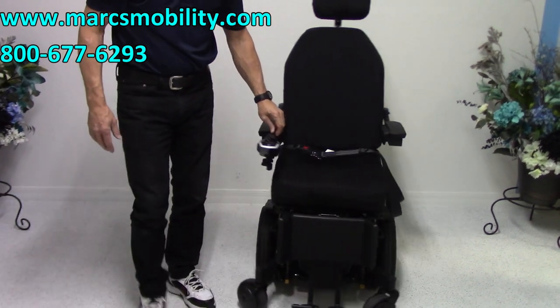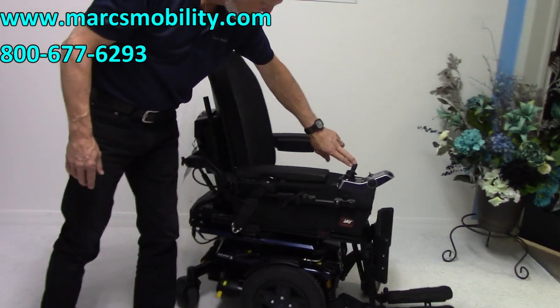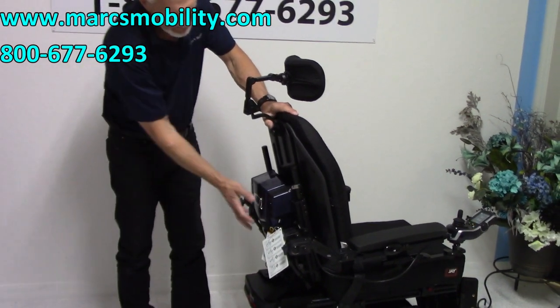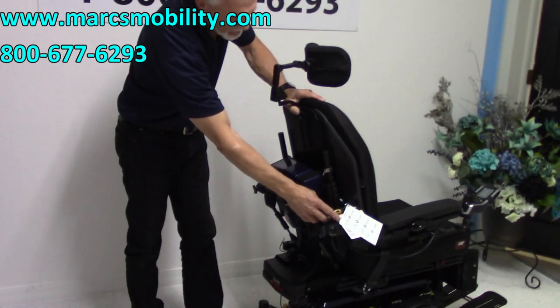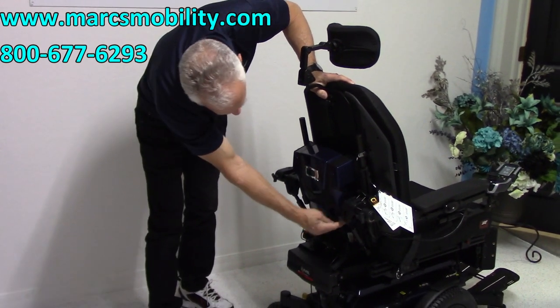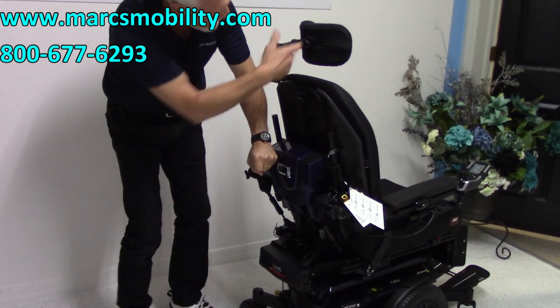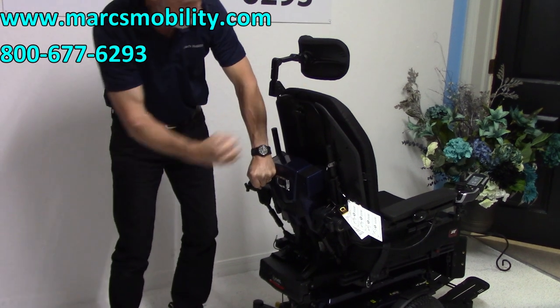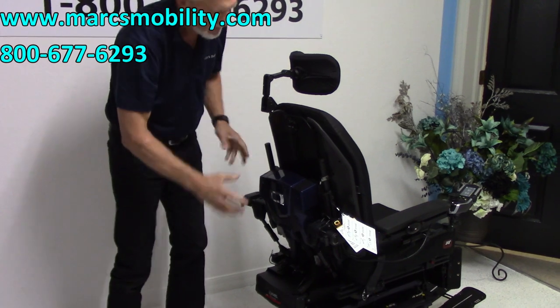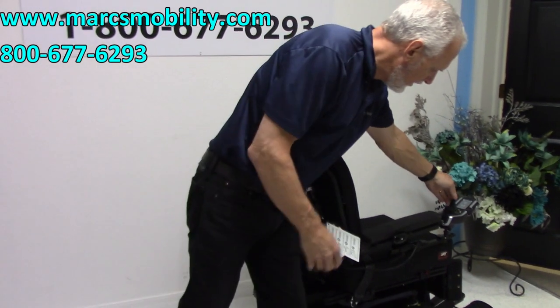The back of the chair is also a manual back. If this back is too straight and you want it more reclined, all you have to do is take this blue cover off — it has four screws. The cover comes up, there's a little handle here with a piston. You pull the handle down, bring the seat to whatever degree you find comfortable for your loved one, let the handle go, and put the cover back on. So it's a manual back with manual legs.